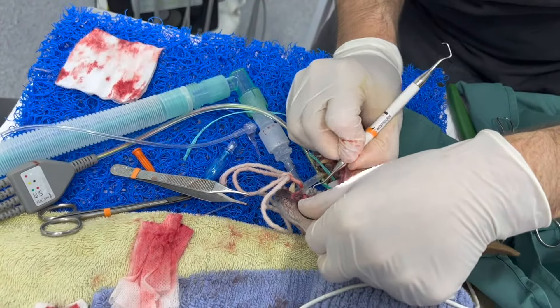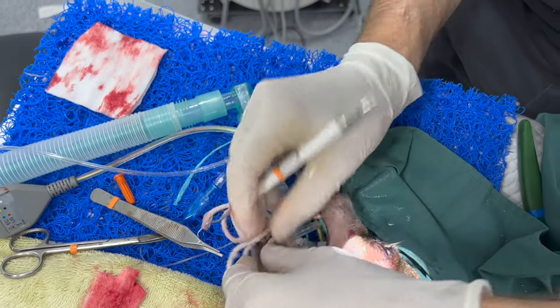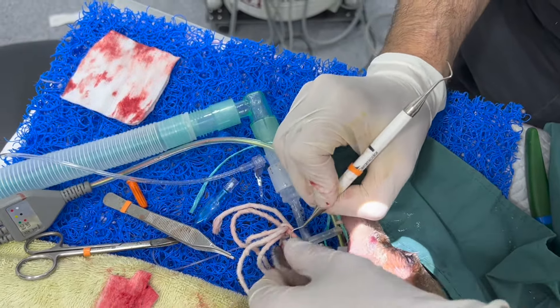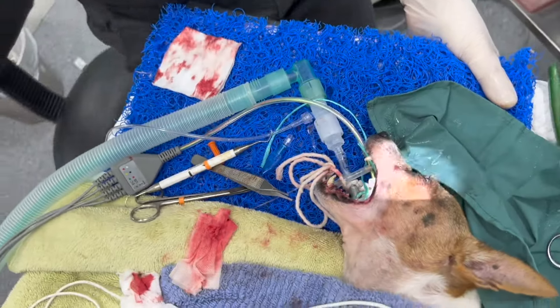I'm going under the gum and pulling along under the gum. This tooth has a lot of recession, so this tooth is probably also due for extraction — but not today.